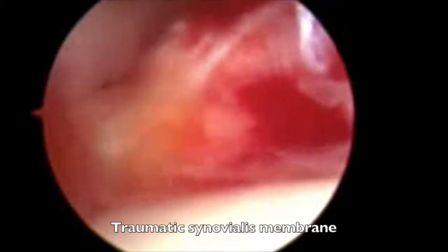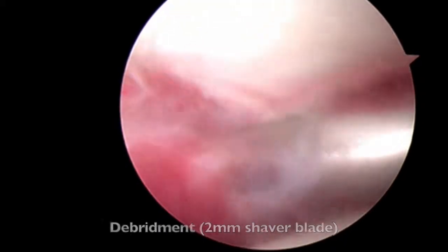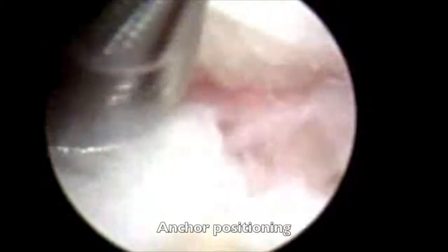Arthroscopic exploration shows a traumatic synovial membrane with bleeding. An arthroscopic debridement is then performed with a shaver blade in order to visualize the ligament tear. Here we see a full tear of the proper collateral ligament.